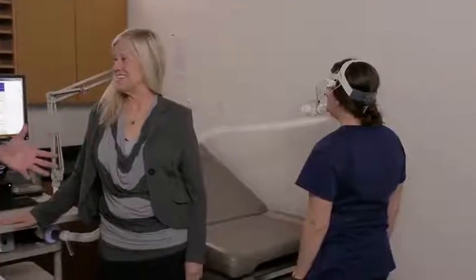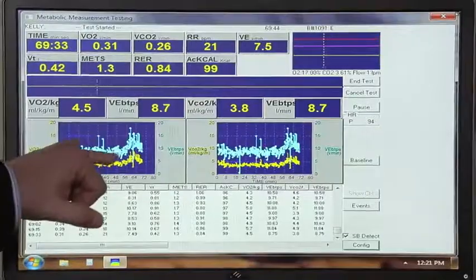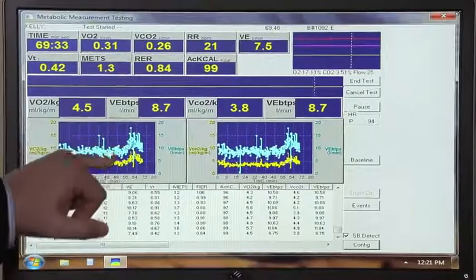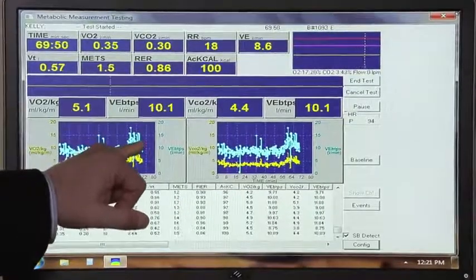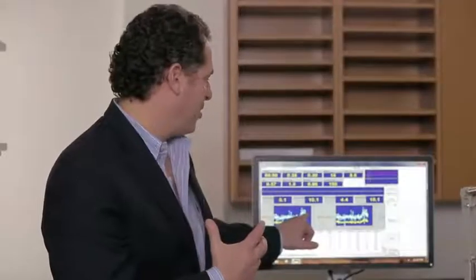Now that Stephanie is in the upright position, we're going to challenge her metabolically and make her do a little exercise. She's going to step up and down at the tempo that our students are going to set as our human metronomes, and we're going to watch what happens to her metabolic rate. You can see that even the fact that she just stood up from the lying-down position has already started to increase her metabolic rate.